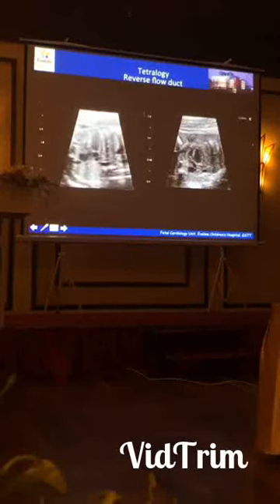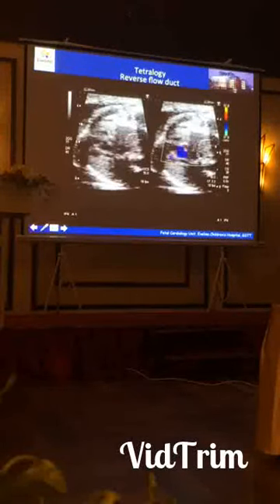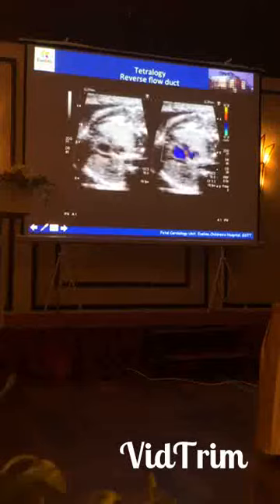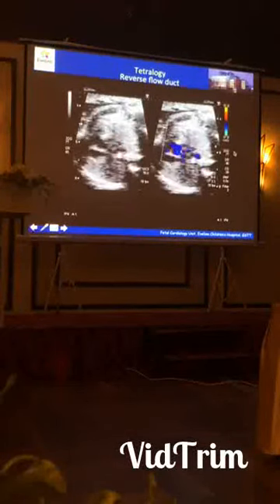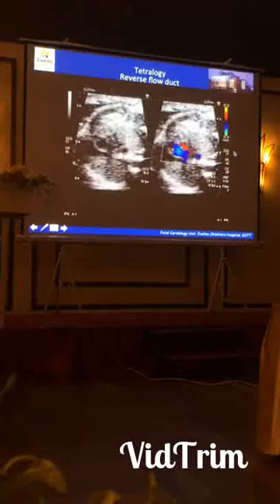Here's the VSD. This is a very small pulmonary artery we're seeing here, so that's the aorta, pulmonary artery. And in this baby, we had some forward flow across the valve, so it's not atretic, but we also had quite a lot of regurgitant flow from the duct. So this baby had quite severe obstruction and did need to have early intervention after birth to establish pulmonary blood flow.